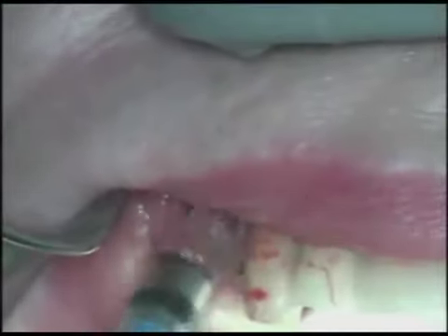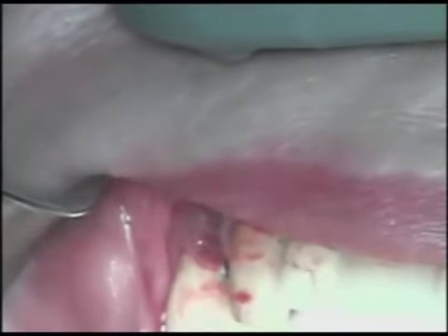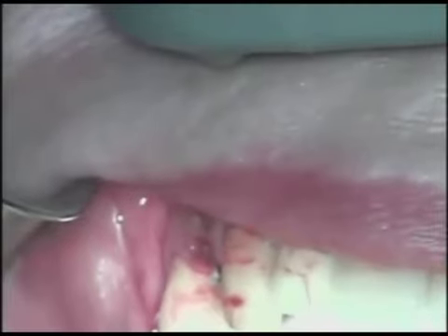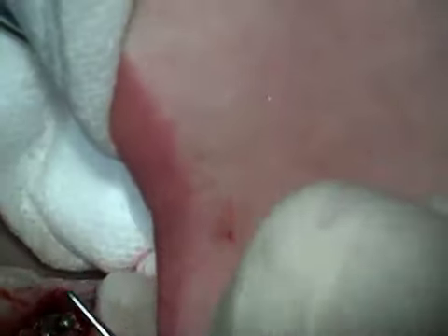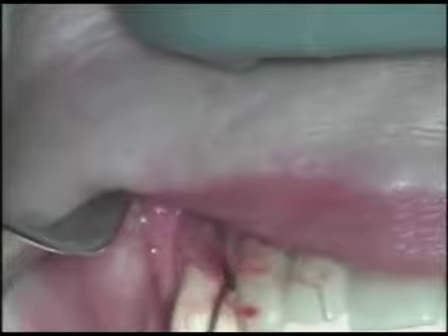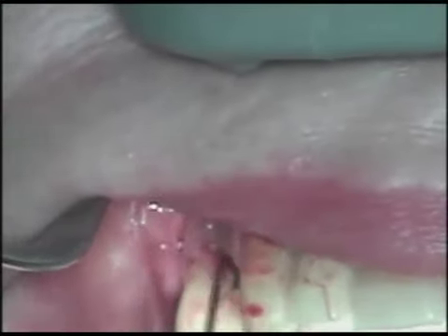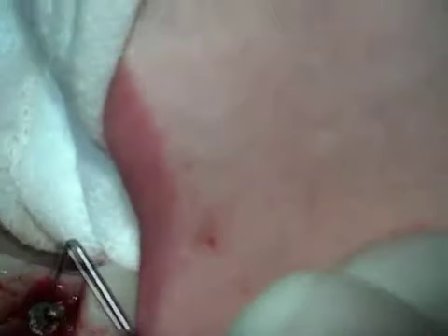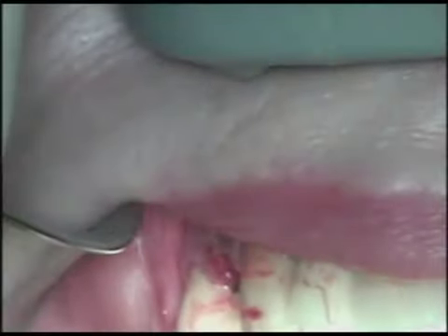Then I'm going to go back and use up the rest of the Grafton gel that I have and pack it around the implant and around the base of the abutment so that I have good bone in there. Since it's such a tight space, I'm going to use my perio probe to actually pack it in there, and I can use that to fill in around the implant. So I compacted the bone down around the abutment, making sure that there is no bone on the abutment so that I can fully seat the provisional crown.